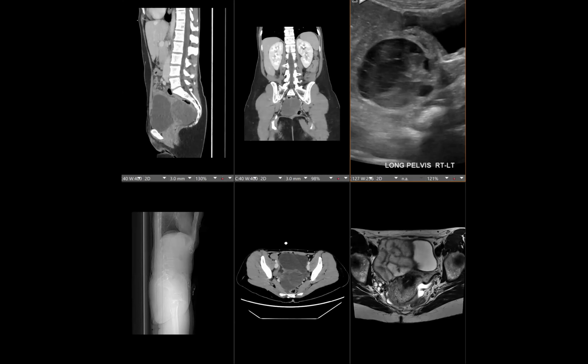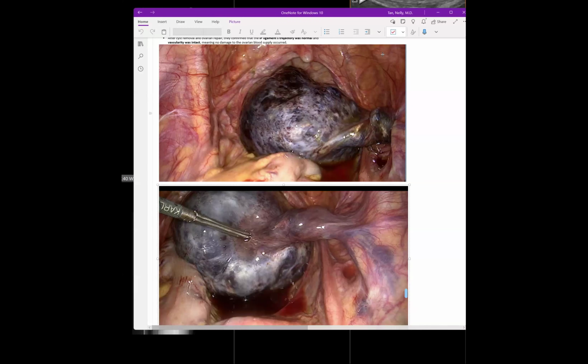I thought it was a torsion ovary, or I said atypical hemorrhagic cyst, just threw it in the differential. And the ultrasound showed a peripheralized, enlarged ovary. Yep, exactly. And this is what the operative images look like. Whoa. Yes. So the gyne surgery said that the right ovary was edematous with dusky appearance, with obvious evidence of torsion around the IP ligament 1.5 times, and an approximately 5 centimeter hemorrhagic cyst noted.